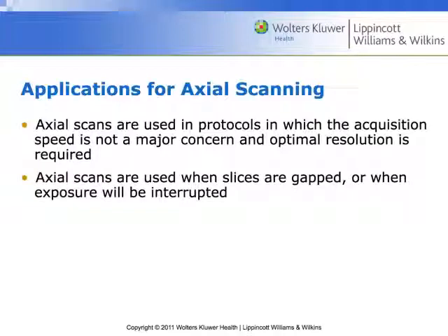and an axial scan is not going to allow the PET CT scanner to run, what is that calculation it does off of the CT images? Are you familiar with that? It does some kind of statistical analysis of the CT images and uses that to understand the PET images. I don't fully understand it, but they would not be able to run that calculation off of axial information.